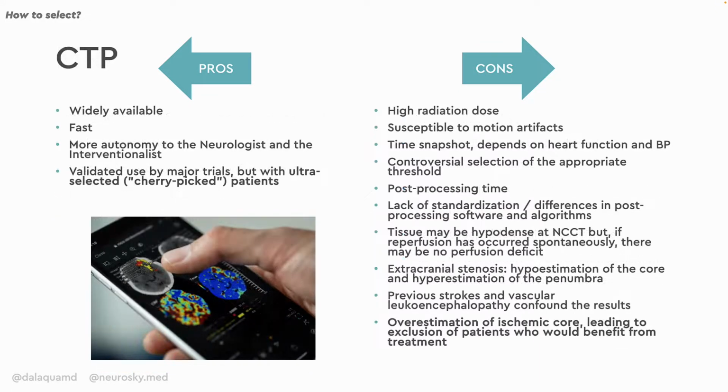So on the other hand, CTP is widely available, very fast, gives more autonomy to the neurologist and to the interventionalist, and it's validated by the major trials. But we should remember trials that had very restrictive criteria and that had ultra-selected and cherry-picked patients.